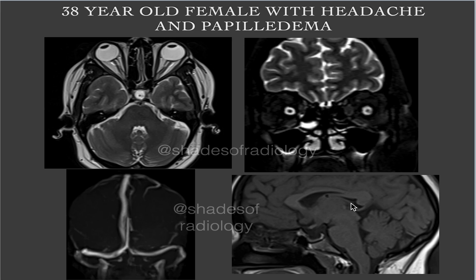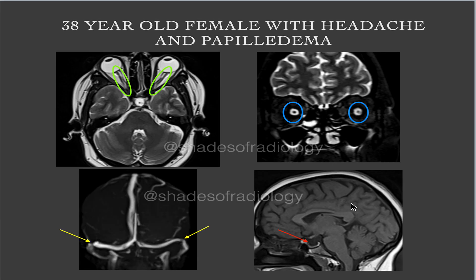Let us go with the discussion of the findings. On the axial T2-weighted image you can see bilateral optic nerves are tortuous, and you can see the prominent subarachnoid space. Even on the coronal images you can see the thickness of the subarachnoid space is increased on coronal T2 fat-sat. On MR venogram you can see a narrowing of bilateral transverse sinus at the groove where it is going to form the sigmoid sinus.